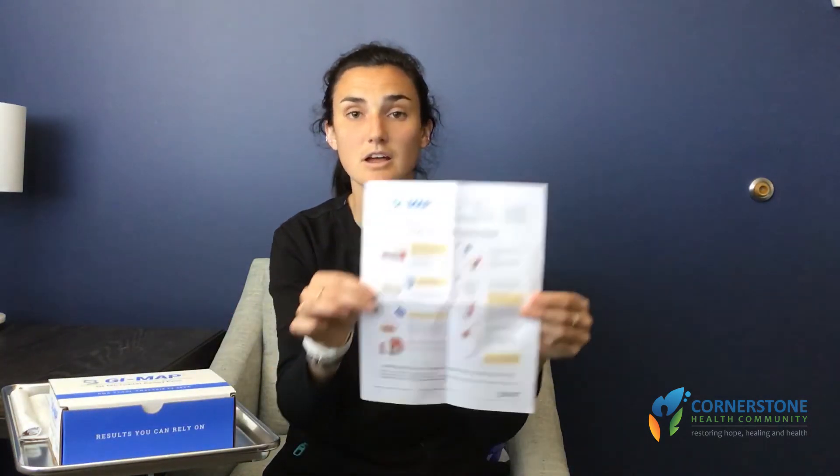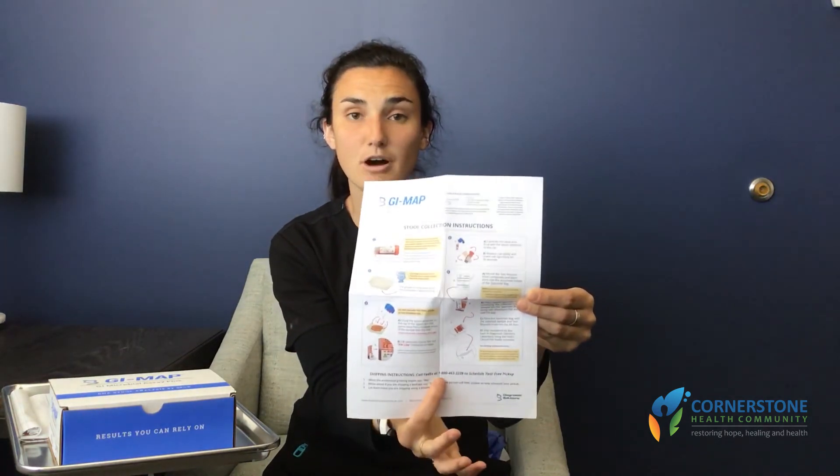When you're ready to ship it out, on the bottom of the instructions from the lab there is a number to call for FedEx. You can call that number and have them pick it up outside your home, or if you choose not to do that, you'll need to find a FedEx drop center in your area that accepts biohazards.